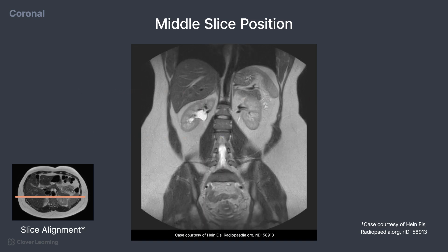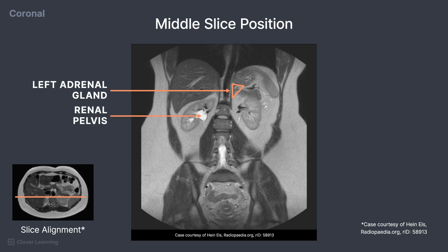Continuing posteriorly, a very small structure is the left adrenal gland located superior to the kidney. This appears like a little triangle on top of the kidney. The right renal pelvis can be seen and appears bright due to the T2 weighting of the image.